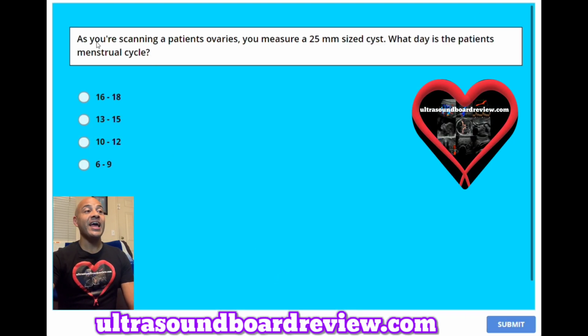Question 26. As you're scanning a patient's ovaries, you measure a 25 millimeter size cyst. What day is the patient's menstrual cycle?